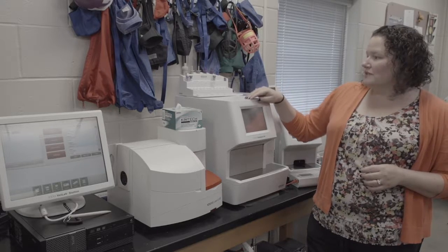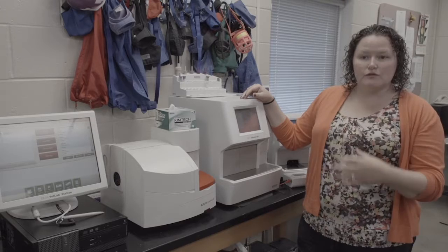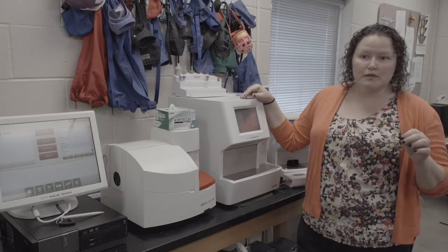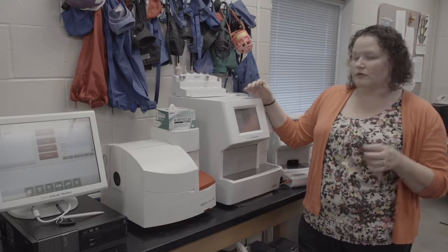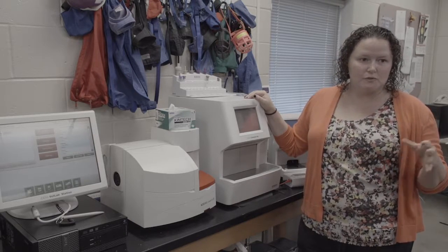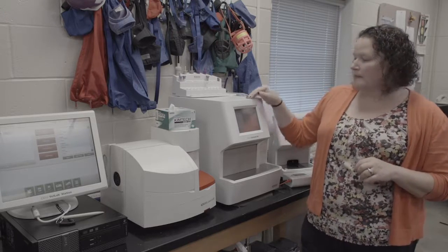So the sample types for this analyzer: you can run a green top tube and spin it down yourself, and that will give you plasma. You can run a red top tube if you let it clot for 20 minutes and then spin it down, and that gives you serum. Or you can run one of our little lithium heparin whole blood separators, which is basically just a green top tube that this analyzer will spin for you and then give you back the leftover plasma.